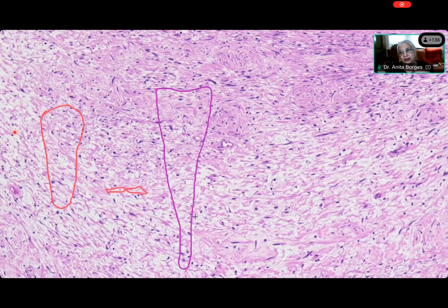They're going to be thinner than that. No, when you grate it, they're long and they are thin. Now everybody can see that the collagen over here, yes, it's long and thin. You don't even need to draw the second line. That is all. That's how this grated carrot looks.